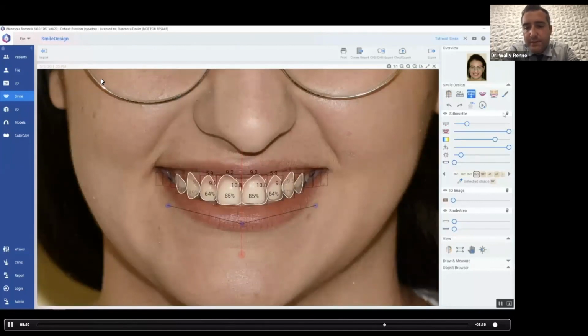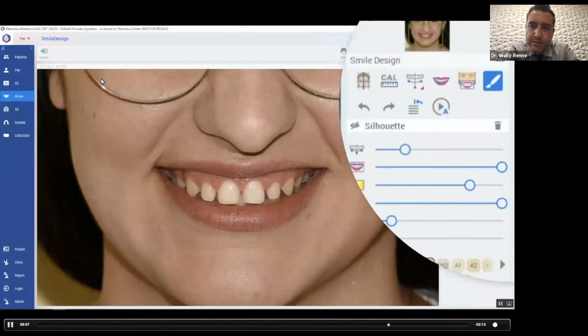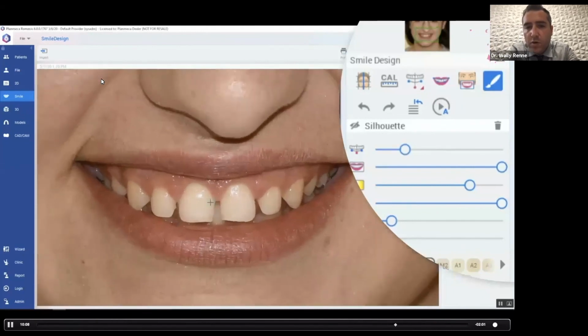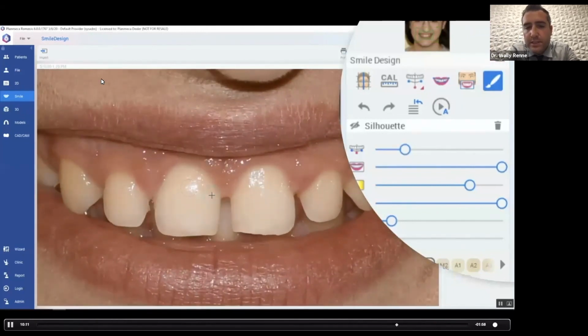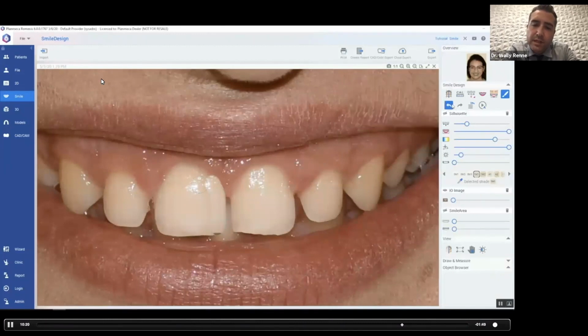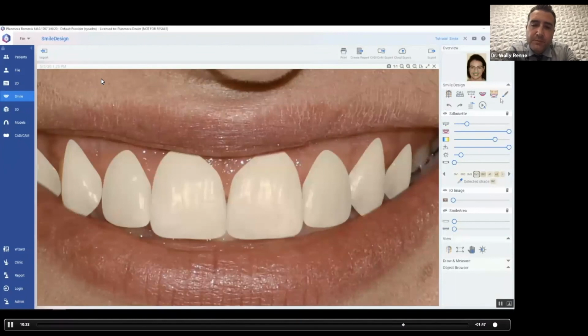But before we go on to the 3D software, I want to show you one last feature, which is this kind of Photoshop for faces. So I hit the little brush icon right there, and I get all these new tools. And there's a ton of cool new tools. There's Warp, which lets you drag tooth structure. There's Mirror and Clone. Clone, I'll show you Clone real quick. Clone essentially just, you click an area to get your clone point, and then you drag, and it's copying that line. Okay, and you do have undos, so you don't have to be scared to screw everything up.